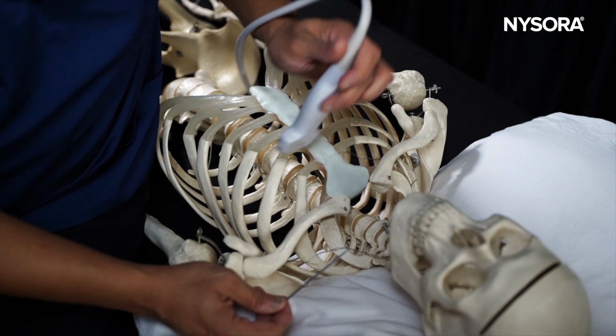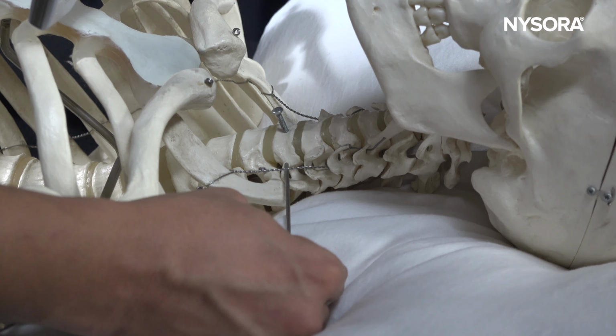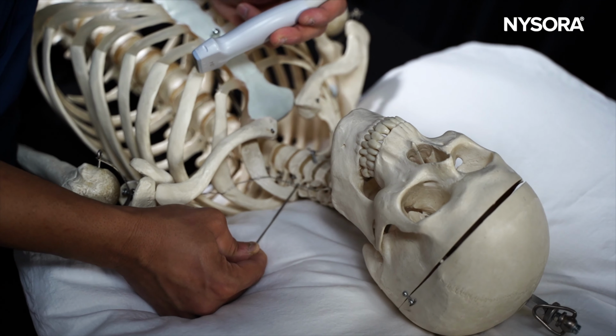So just to recap, start from the midline, scan, move laterally, look for either C7 or C6. At C7 level, you don't have an anterior tubercle, you only have posterior tubercle, and you have vertebral artery that's exposed here, and then you have C7 nerve root. At the level of C6, you have an anterior tubercle, posterior tubercle, and the nerve root is basically between the two. Same thing happens at C4 level, C5 level, you have anterior tubercle and the posterior tubercle.